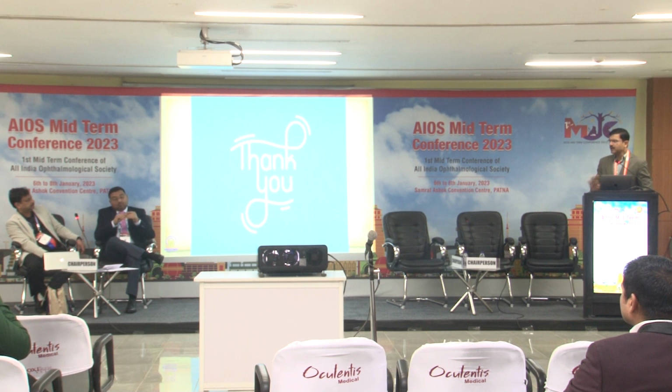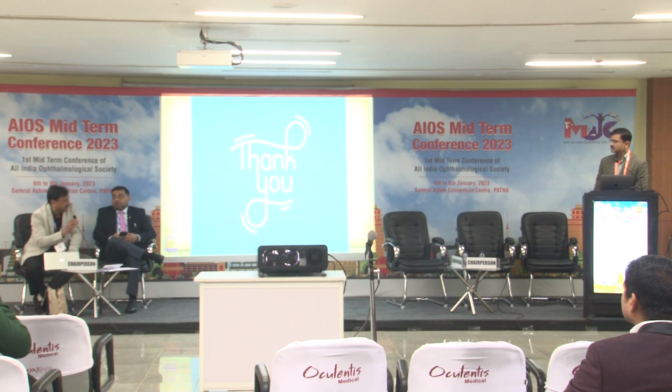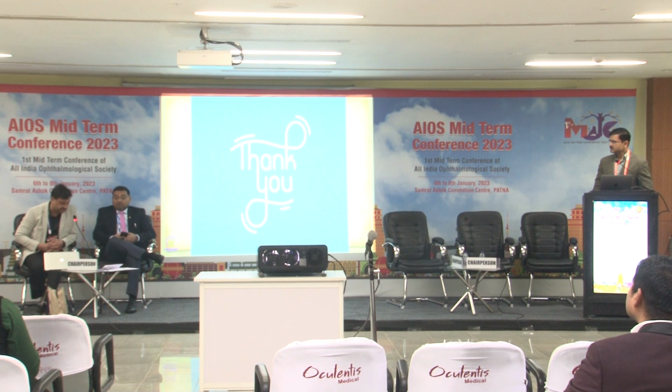for other patients, by and large, it behaves very well in terms of rotational stability, even if the size of the eye is variable. I think that is one of the major concerns with all these toric IOLs, and with my personal experience also, Hoya is doing amazing. Their rotational stability, though on the table it looks as if it might flip, actually doesn't translate so. Absolutely. It remains where you have actually placed the lens. And I fully agree, whether you go clockwise or anti-clockwise, in either way you can easily manage the lens, and then it remains stable there.